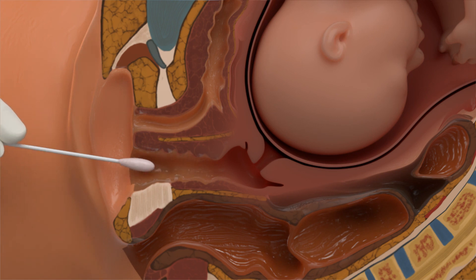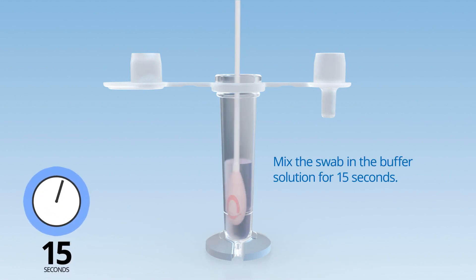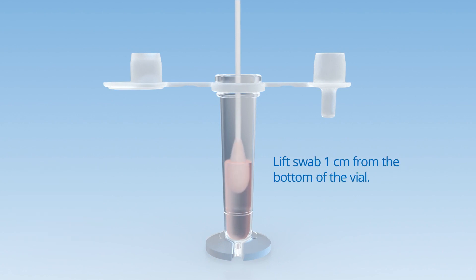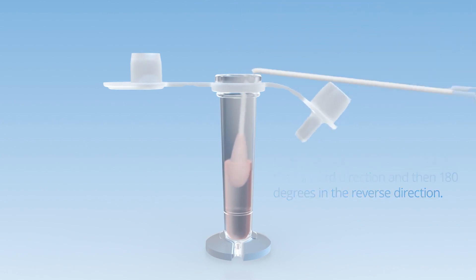Collect the specimen and withdraw after 15 seconds. Swirl the swab in the vial containing the Buffer Solution for 15 seconds. Break off the swab tip by slightly lifting the swab about half an inch. Leave the swab tip in the vial and dispose of the remaining portion.